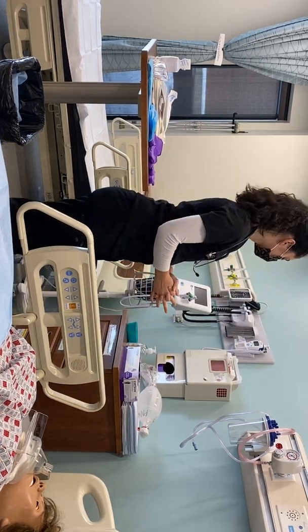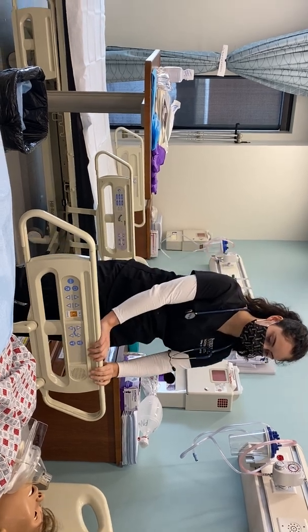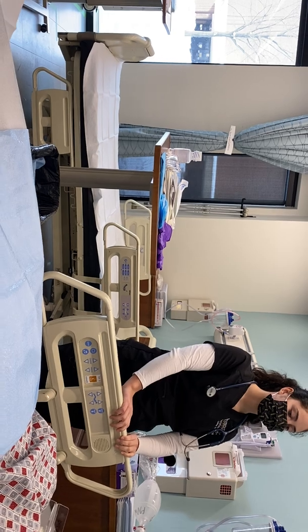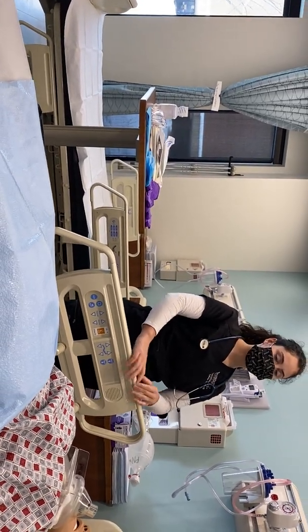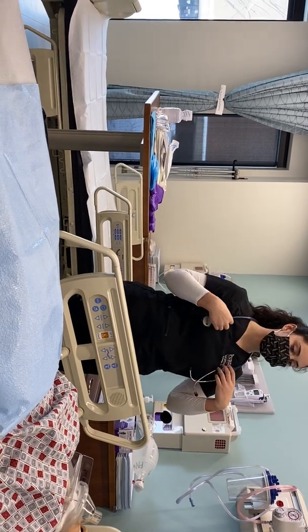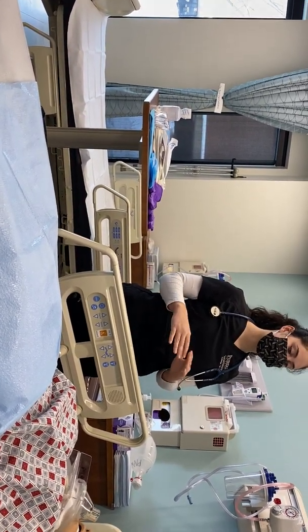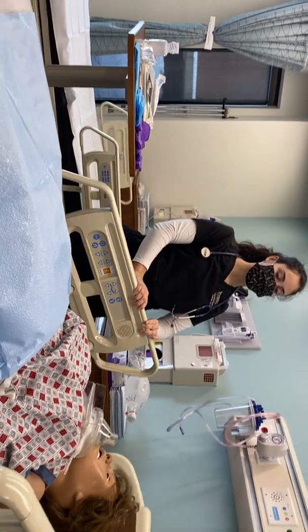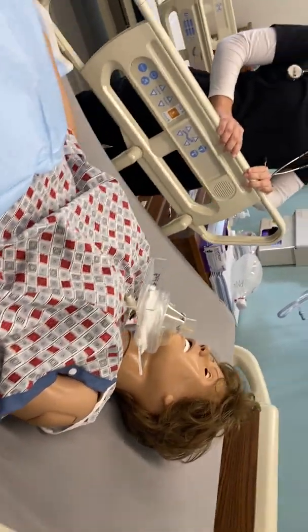All right, perfect. So now that that's done, I'm going to do hand hygiene again. I'm going to raise your bed up. Okay, and also just to let you know, I'm going to provide privacy by closing the curtains and the doors, okay? And if you need to stop this procedure at any time, you can just raise your hand up. And also if you are experiencing any respiratory distress, we will stop the procedure, okay? All right, perfect.